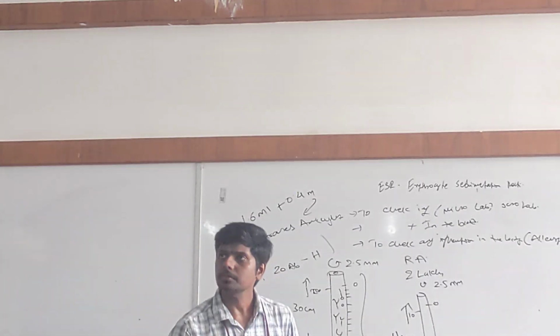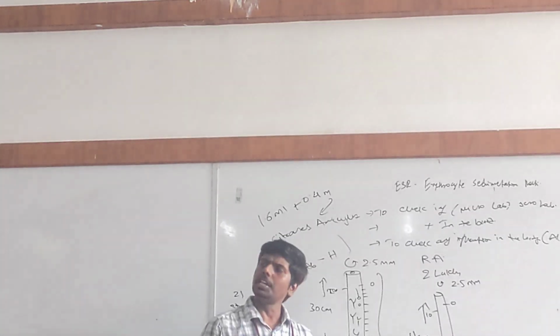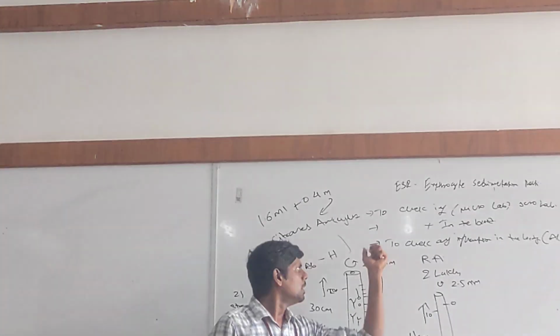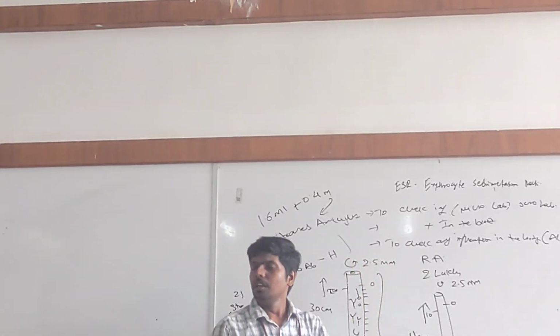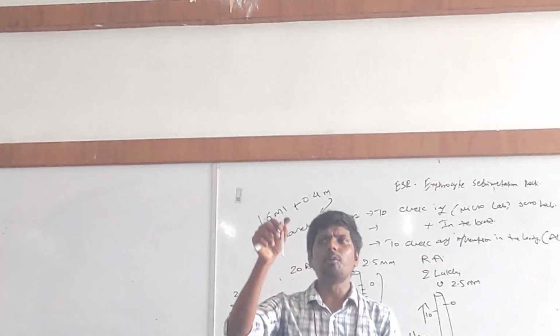Is it clear? In Wintrobe's we can use EDTA also, but this is for Westergren's, and Westergren's is the gold standard.